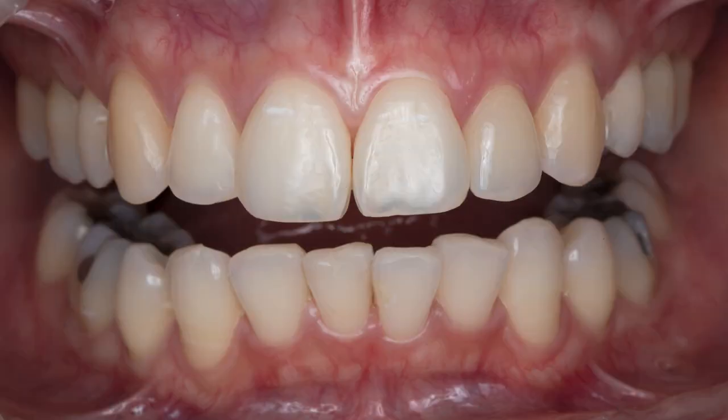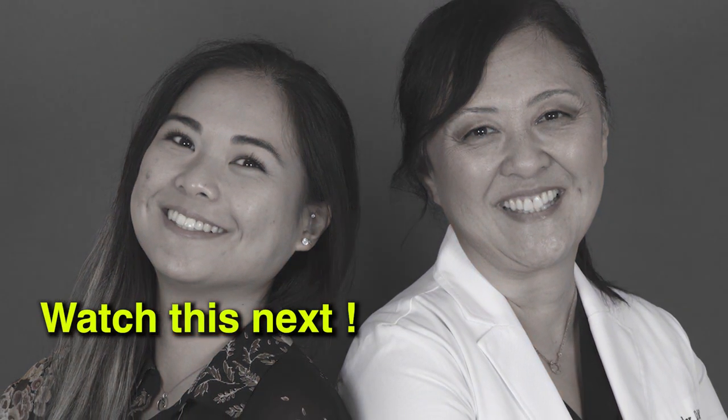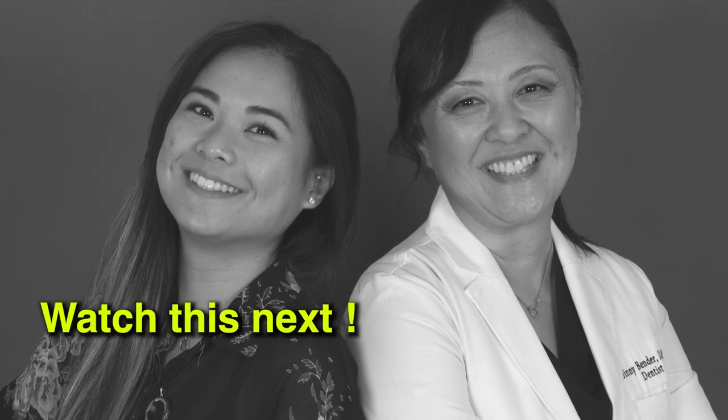The ability to scan a patient, design a crown, and mill a provisional chair-side and easily deliver the restoration allowed me to personalize the treatment plan with greater flexibility, resulting in a beautiful result. I was so happy to reconnect with my former patient to deliver a brand new smile.